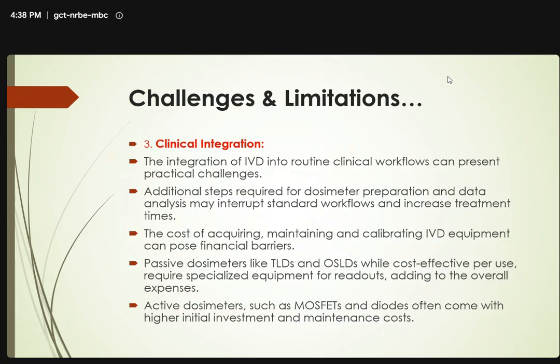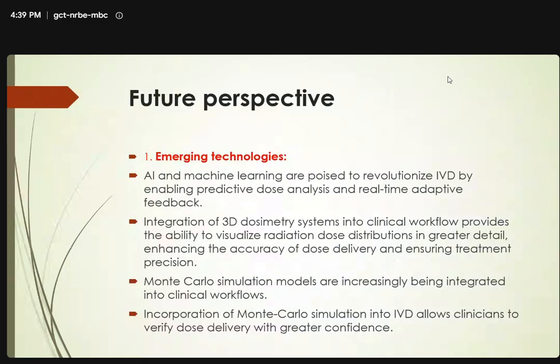And active dosimeters such as MOSFETs and diodes often come with a very high initial investment and maintenance costs. So there are challenges also to incorporate IVDs in the clinical setups.